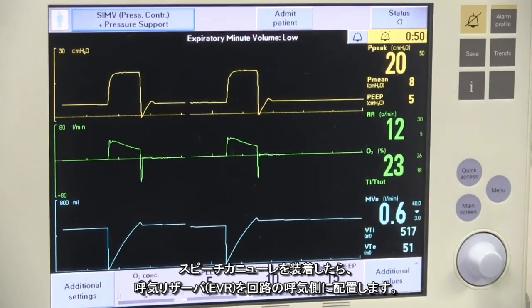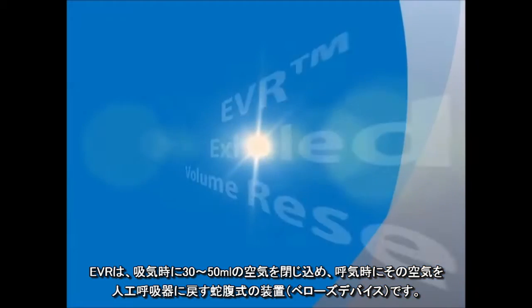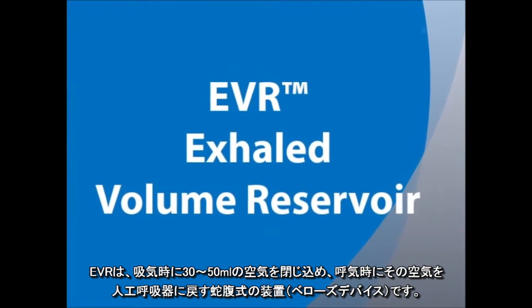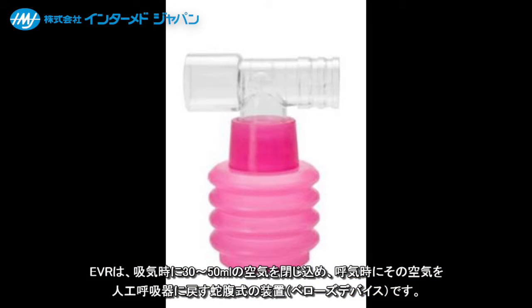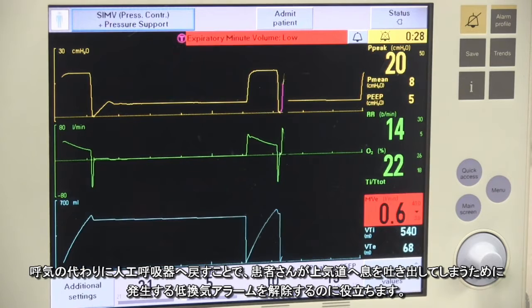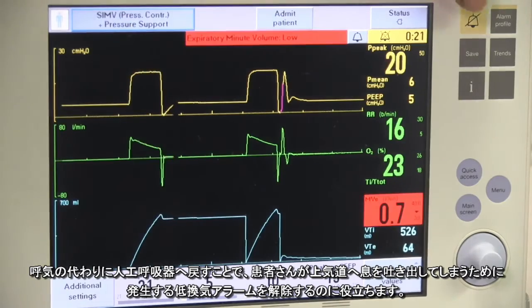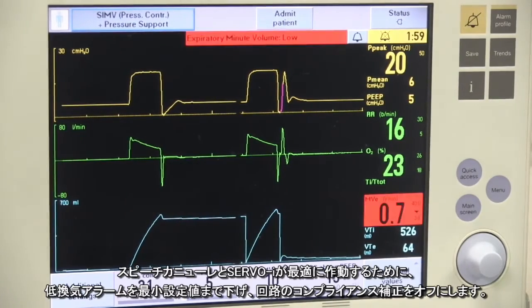Once you have the speech cannula in place, place the exhaled volume reservoir into the exhalation side of the circuit. The EVR is a bellows device that traps 30 to 50 milliliters of air during inhalation and returns it to the ventilator during exhalation. This device helps to eliminate the obligatory low volume alarms that occur whenever a patient is exhaling through their upper airway instead of back to the ventilator.